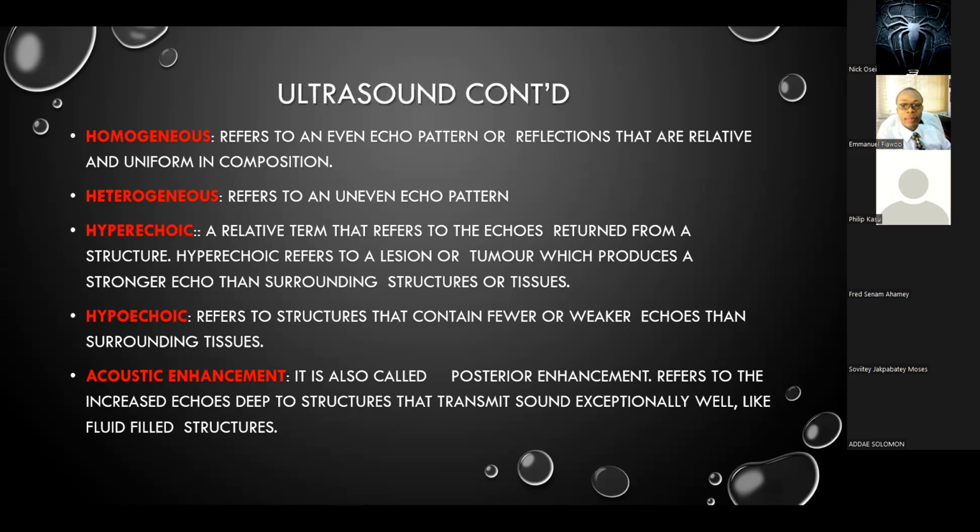So hyperechoic simply means that it is reflecting a lot more sound, or it is very echogenic, whereas hypoechoic means that it is not very echogenic, and so it is reflecting less, allowing much of the sound waves to pass through.